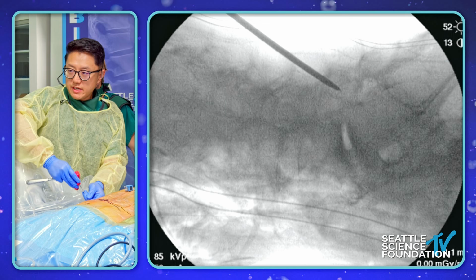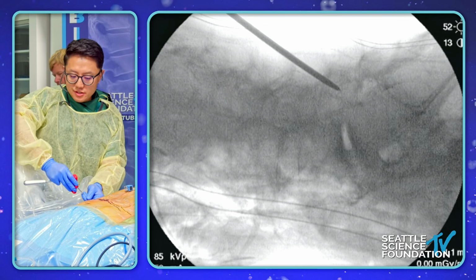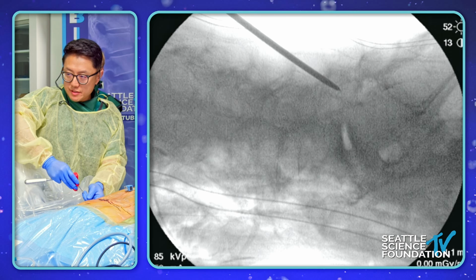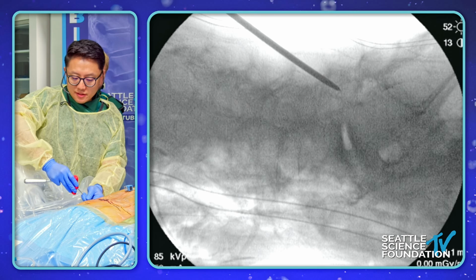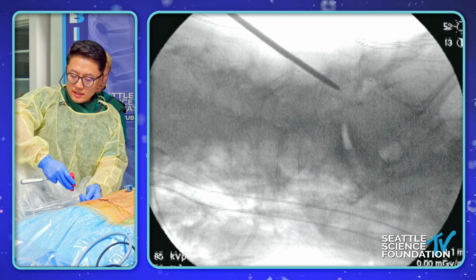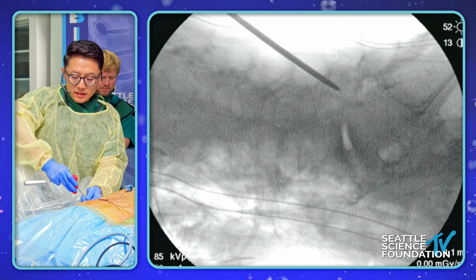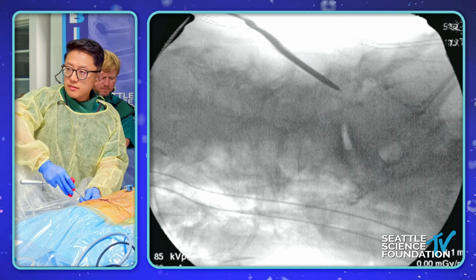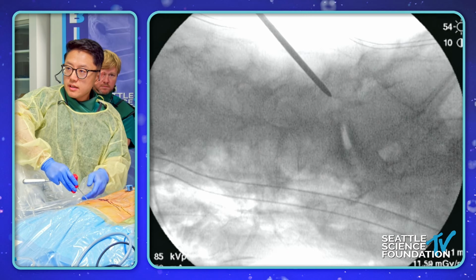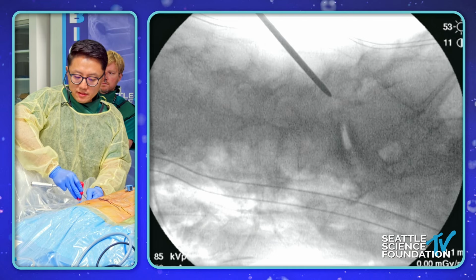Trigonometry is going on. So basically, I'm trying to target the base of the SAP and the pedicle junction. I think we probably started off a little bit more lateral than intentional because of the original rotation, and so we're coming in at a very flat trajectory. So what I'm feeling is that essentially I'm sliding directly into the foramen. Let's see one more shot right there. Yeah, this is going directly into the foramen because of the flat trajectory.